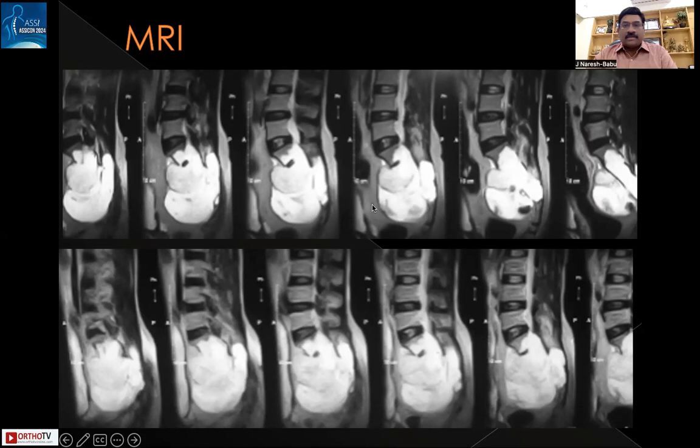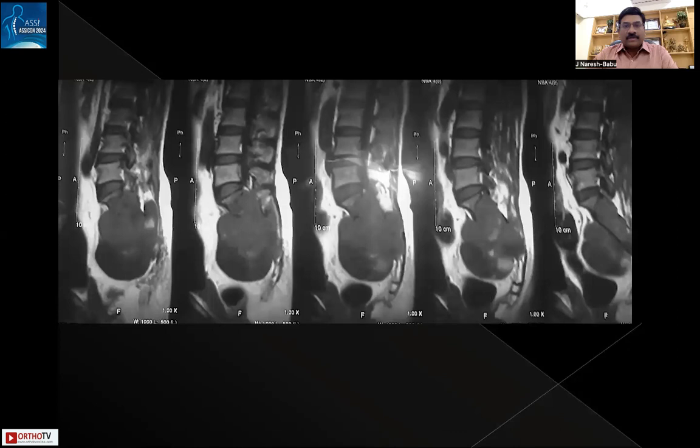This T1-weighted MRI image shows the extent and size of the tumor. A remnant of the sacrum is spared, but the entire distal sacral segments are involved. There is relative sparing of the distal coccygeal segments, with encroachment into the canal and posterior soft tissue.